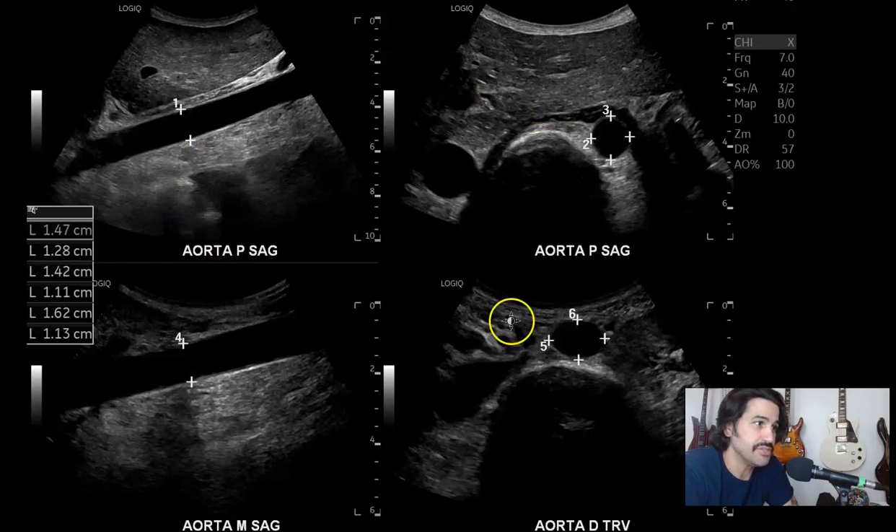Now I didn't measure these all at the same time. I usually measure proximal, then mid, then distal. But after I finished the imaging, I did this quad screen to do all the measurements on one page, as opposed to having a whole bunch of measurements. So you have proximal, sagittal.